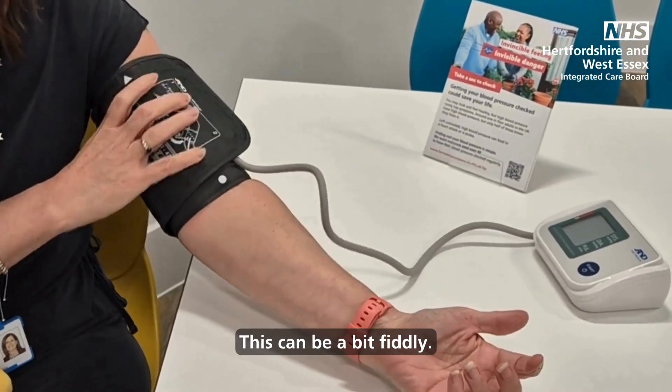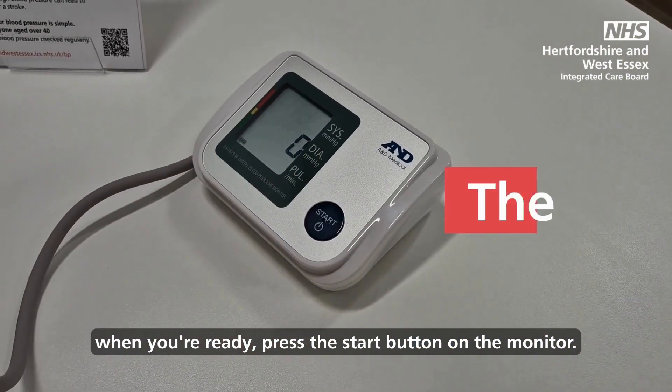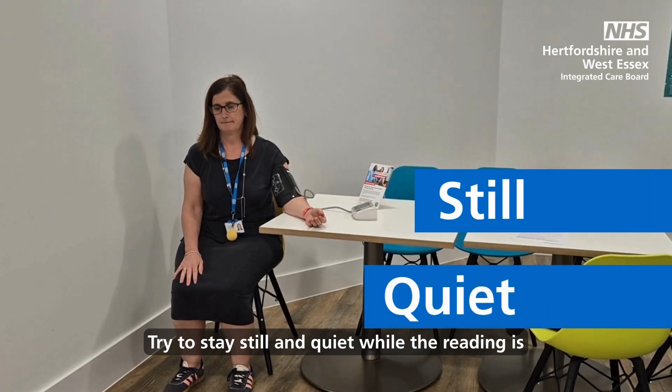This can be a bit fiddly. Take a few deep breaths and when you're ready, press the start button on the monitor. The cuff will get very tight for around a minute.